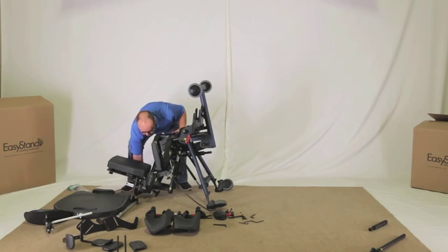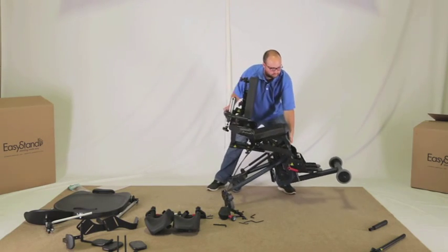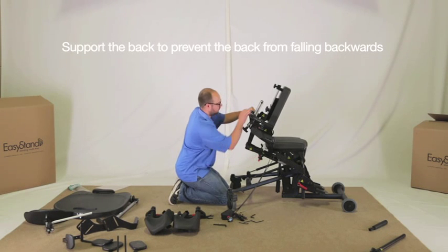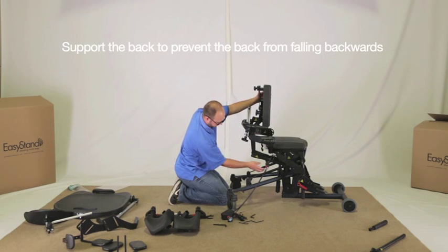Carefully flip the unit back to the neutral position — you may need an assembly buddy to help assist you with this. Loosen the following arm knobs and position the back at 90 degrees. Tighten knobs securely.